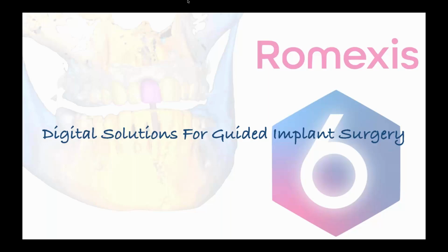But I can't think of a better testament for Romexis than our perio residents, who I spend the most time with. They really have their choice of the major implant planning software systems, and I find that they gravitate towards Romexis when they're planning their cases on a day-to-day basis. There are some reasons for that, and I'll share those. People who are given the freedom to choose tend to use this one because not only is it powerful, but it's also very, very elegant and very easy to use. So we'll definitely discuss that more.